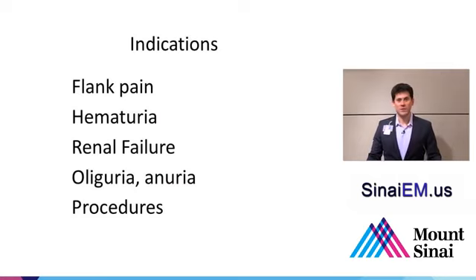So a lot of reasons why you would consider doing point-of-care assessment of the kidney in a patient: flank pain, hematuria, kidney patients with acute renal failure, anuria, or doing procedures.